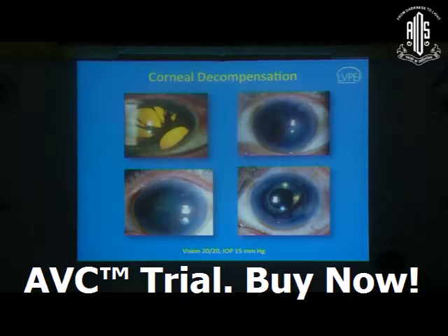Like I said, although the tube is not touching the cornea, we know that it is a dynamic thing. Each time you're trying to close and open the eye with the lid squeezing on the cornea, the relationship between the tube and the cornea are not constant always. Sometimes they keep coming and opposing, especially if there is a decrease in pressure.